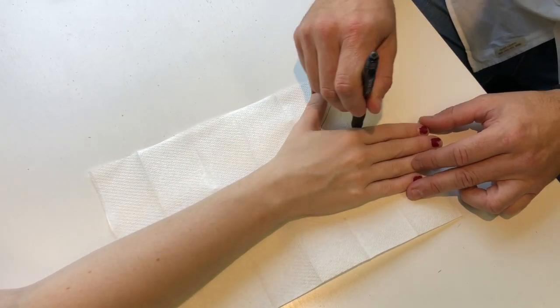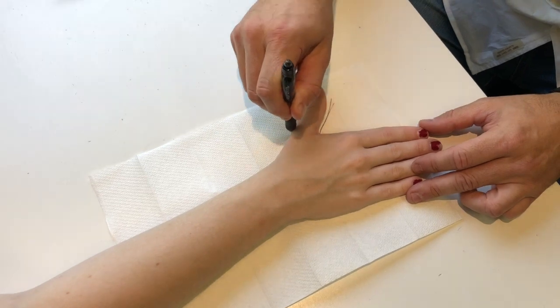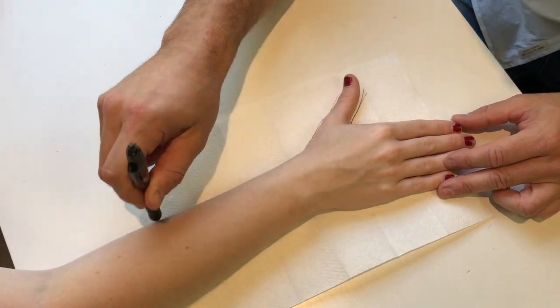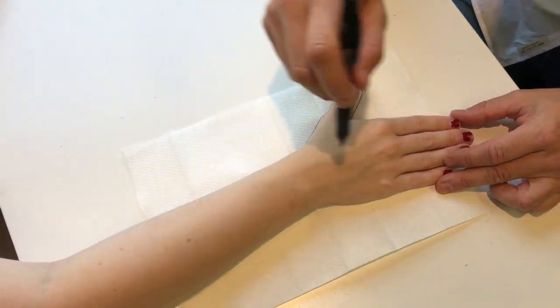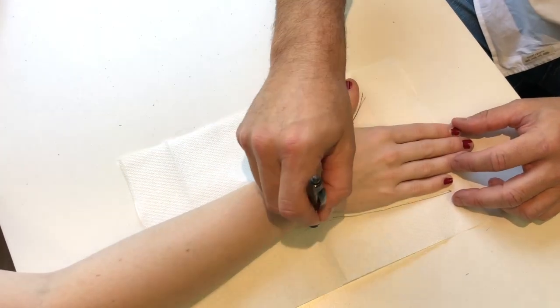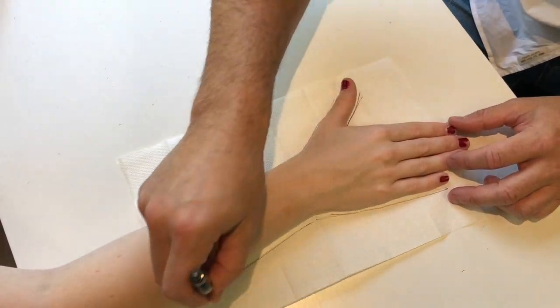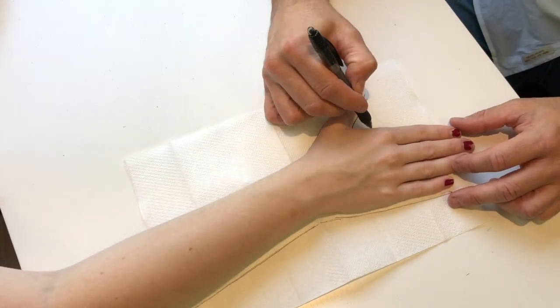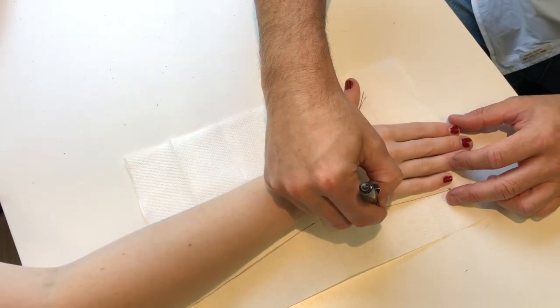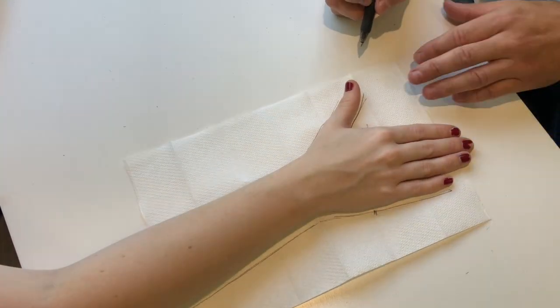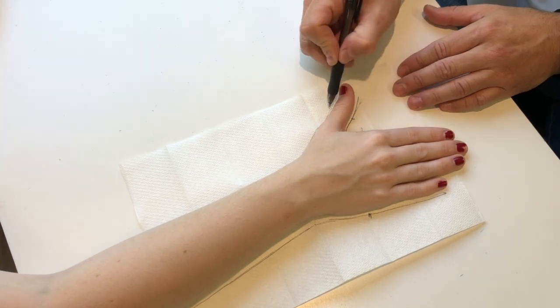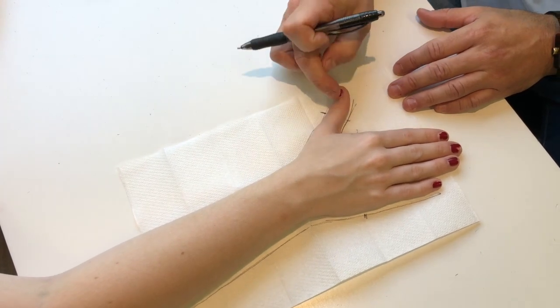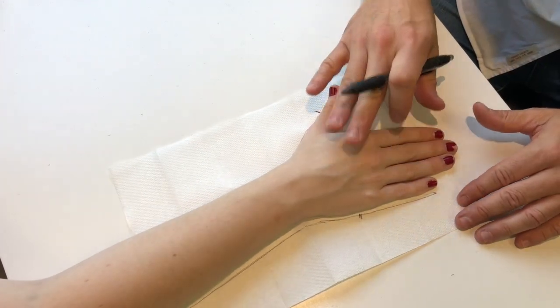We're taking a normal outline, just like we did with the thumb hole wrist orthosis. Similar again, we need a distal palmar crease which forms the distal edge of our splint. A slight difference on this one though, we need the thumb IP joint. You can take your hand away.